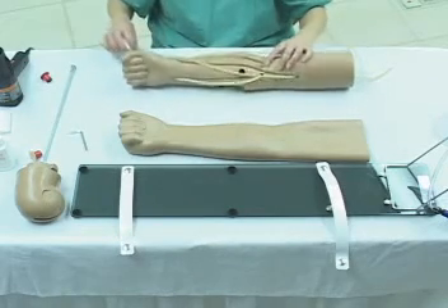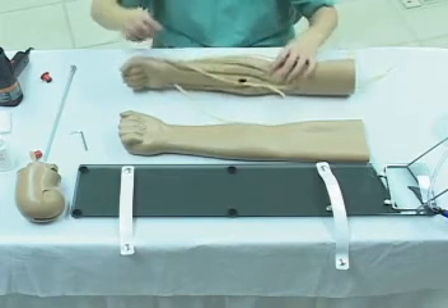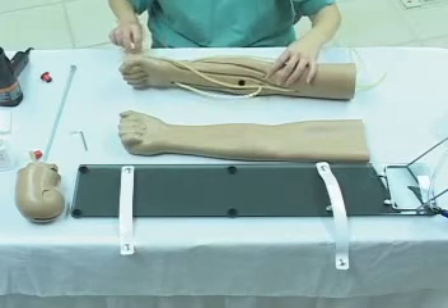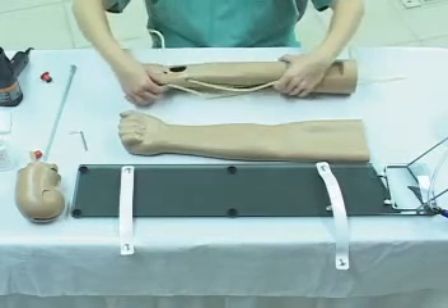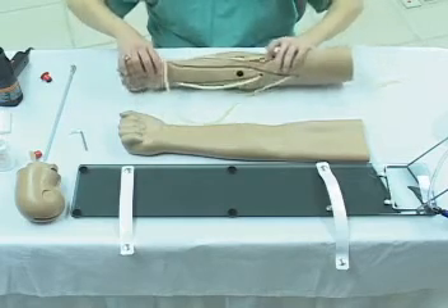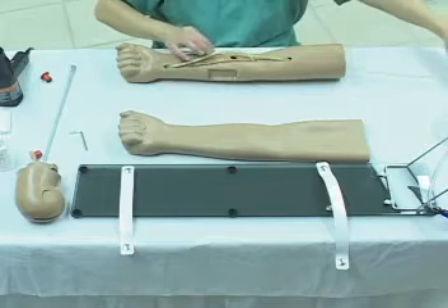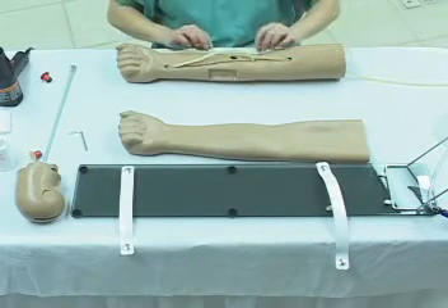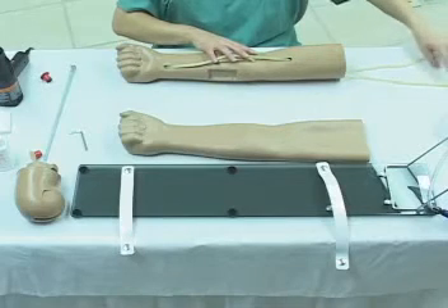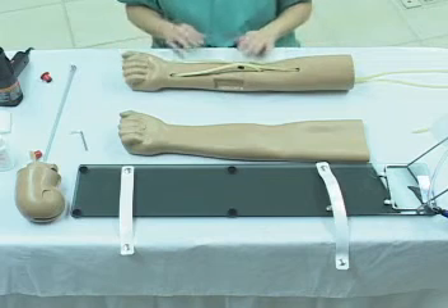At this point notice that we've used a single piece of latex tube. What we're doing is we're adjusting the lengths to have them even. The process right now is basically complete. Notice how we've used the access port rather significantly, and everything is being smoothed out, drawn in place. And that's it.